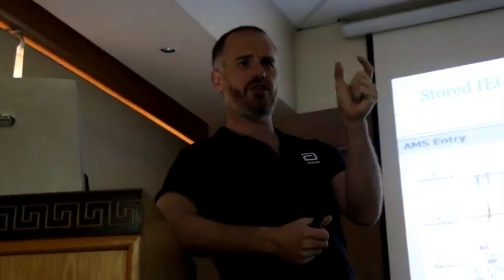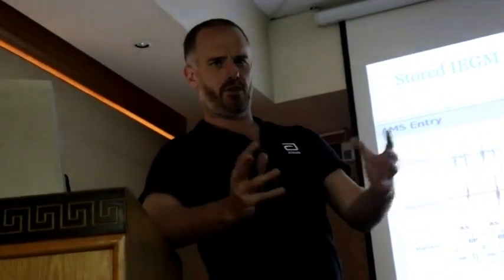So we talked about QuickOp yesterday, and what it does, it tries to measure the duration of the P wave. If you put a pacemaker into her and you went with nominal pacemaker settings, AV delay settings, you would chop off her atrial drive, her atrial kick, essentially. I've seen that with dual chamber pacemakers, in a lady with long-standing hypertension. She had a stiff ventricle, so her ventricular filling was really dependent on atrial kick, right? And she had a broad P wave.